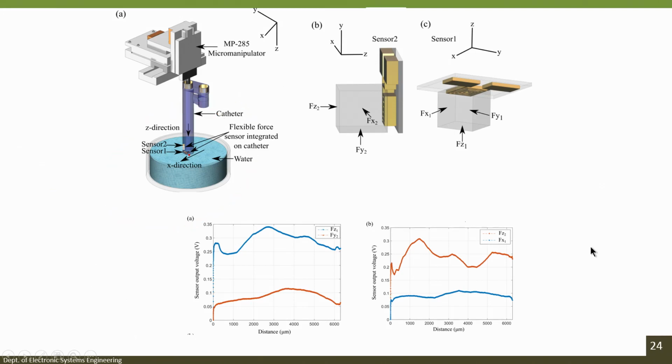So, this is how we can do the experiments, and this is the last slide for this particular module. What I want to say is that with the help of a lithography system you can design several sensors. One of the sensors I have taught you in this module. We can use an electronic conditioning system using an operational amplifier and connect it with this kind of sensor, so that we can see the corresponding change in the force values at the display terminal. Alright, so till then you have to take care.